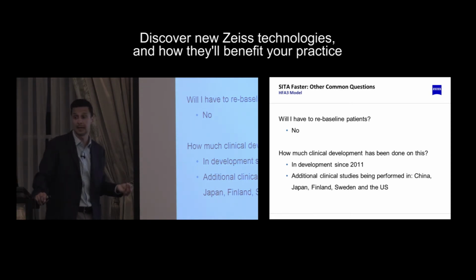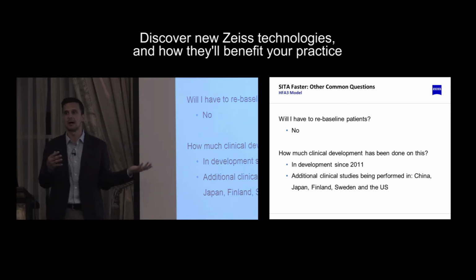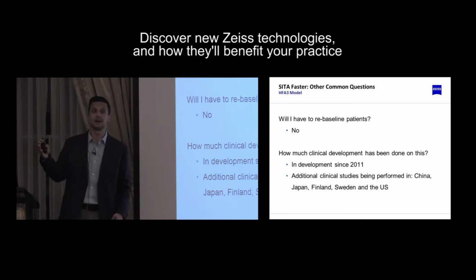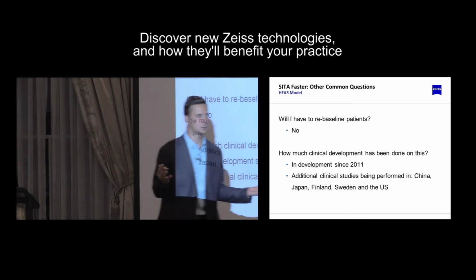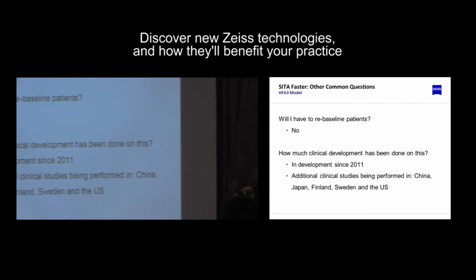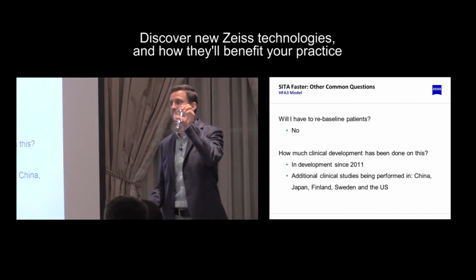So if you have an HFA3 now and you are saying, well, how do I get this? Do I have to go buy a whole new unit? I'm going to step out on a ledge here and say it's an upgrade in the software. And I thought I heard, does it cost anything? No. So the software upgrade on the HFA3 for Sita faster doesn't cost anything for those of you who are already using an HFA3. Okay? Not an HFA2, HFA3.